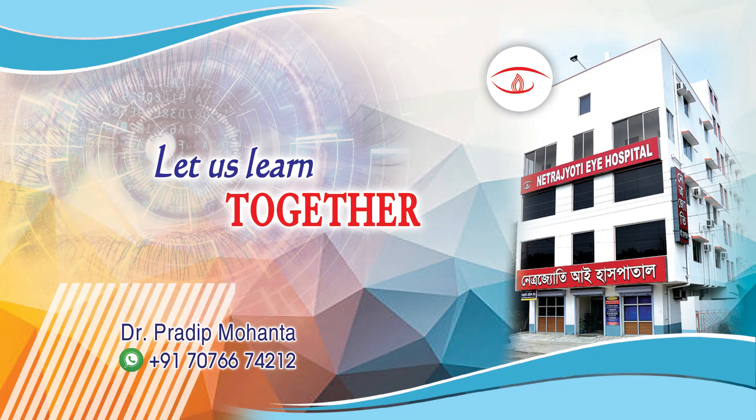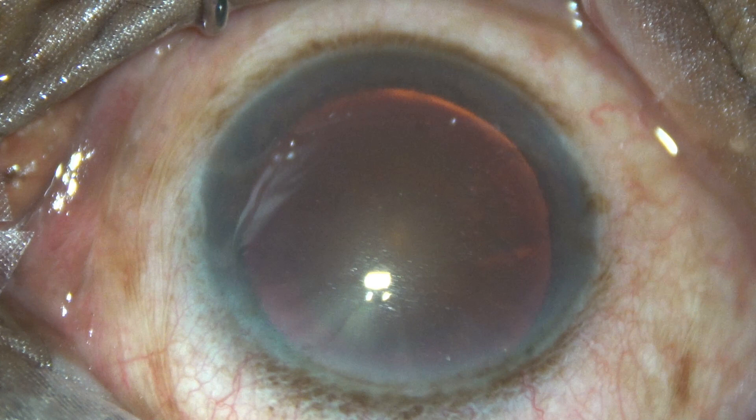Friends, welcome to my workplace at Ranakha, West Bengal, India. This is a very hard cataract. Let us observe this surgery.